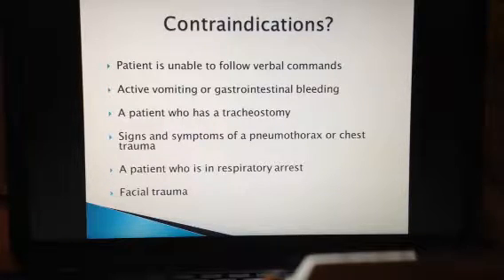And then a patient who also has a trach, signs and symptoms of a pneumothorax or chest trauma, or a patient who is in respiratory arrest, and then facial trauma. Obviously, we're not going to give it to somebody with facial trauma because how do we secure it to their face? Because that face mask seal, that tight one, is really, really important.